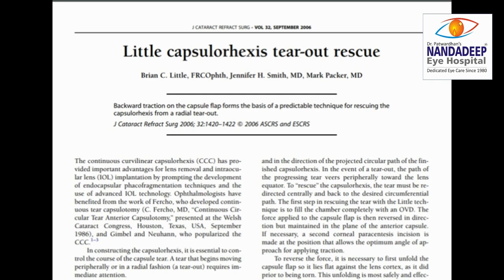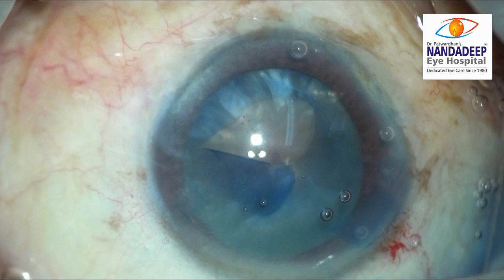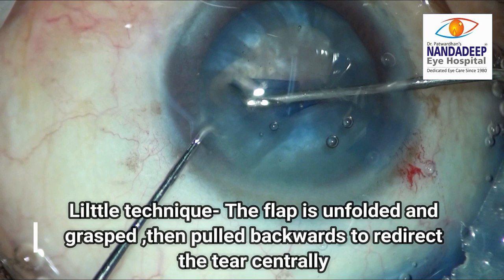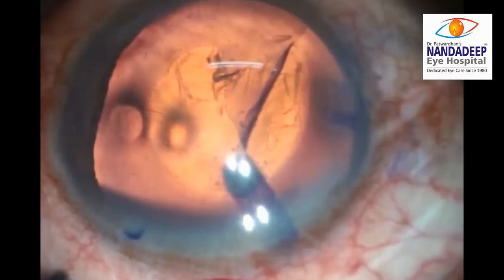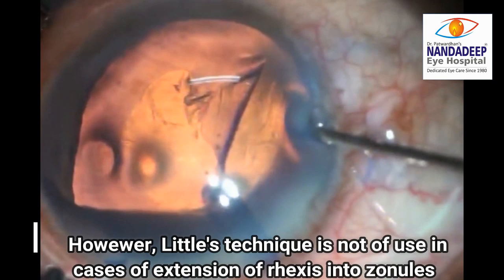Little's technique by Brian Little has been described to rescue the CCC in cases where the tear is going out. In Little's technique, after filling the chamber completely with a viscoelastic, the flap is unfolded and then grasped near the root of the tear. It is then pulled backwards to redirect the tear centrally. However, in the more extensive cases where the rhexis has extended to the zonules, Little's technique is not of much use.